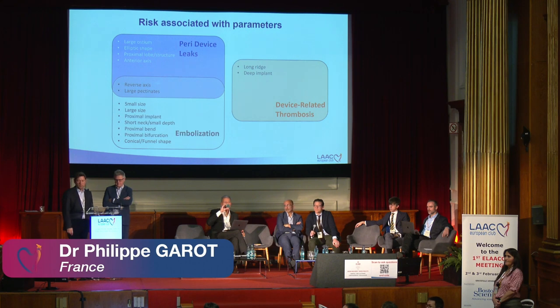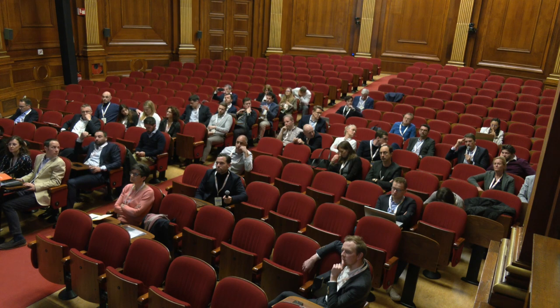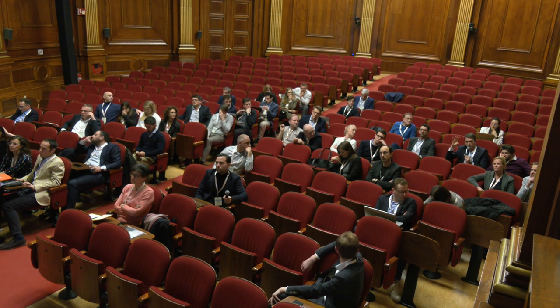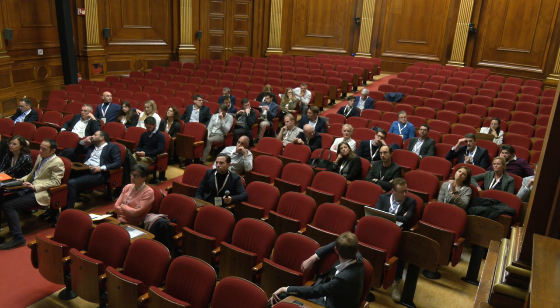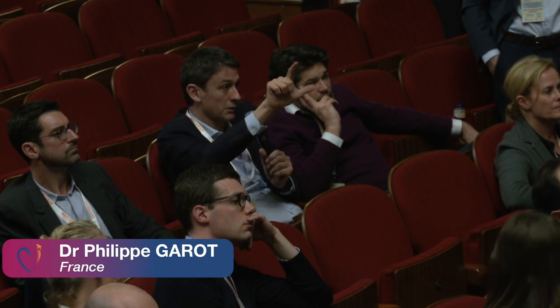Just one comment regarding the previous slide. You talk about complexity, but I think it's not only the complexity of the LA anatomy, but the complexity of the procedure. So in that view, I think the alignment between the fossa and the LAA is very crucial. And for me, the most challenging procedures are when the alignment between both is more horizontal and vertical. Very difficult to give very precise numbers for that, but I think this should definitely be taken into consideration.